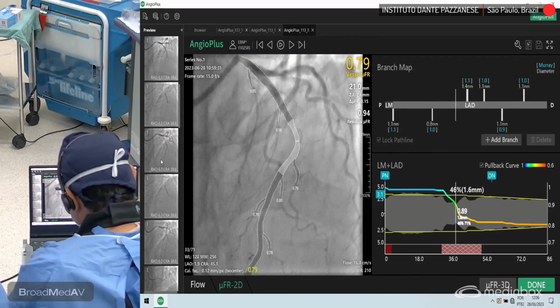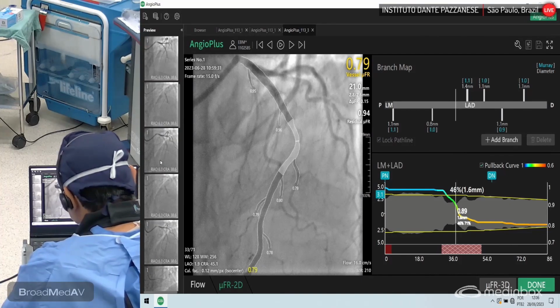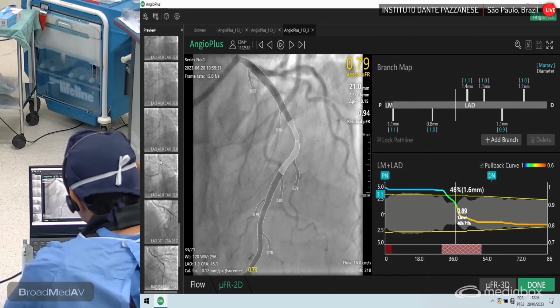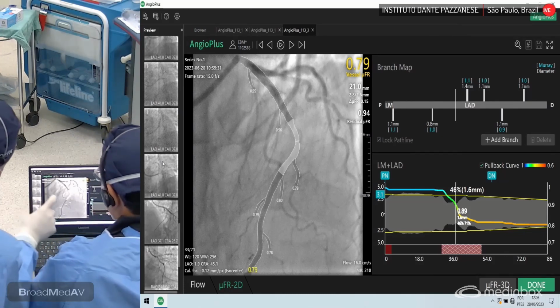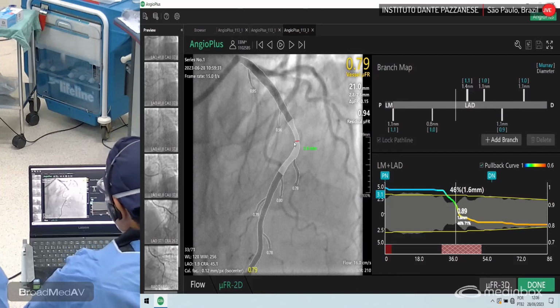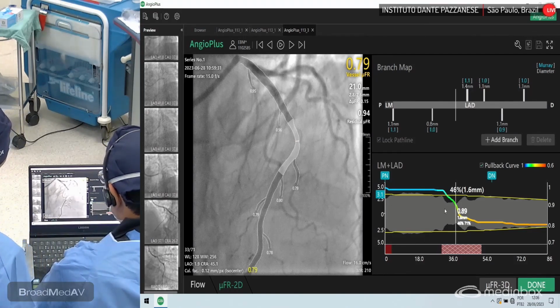And so what we're trying to do is, basically you have two components here. You have a lesion in the left main, you have a lesion in the LAD. Can you tell us which one is more significant to the final result here? Basically you have to take just the step between each lesion. Because I see here you have the cursor, and you can navigate. Can you navigate and show us?